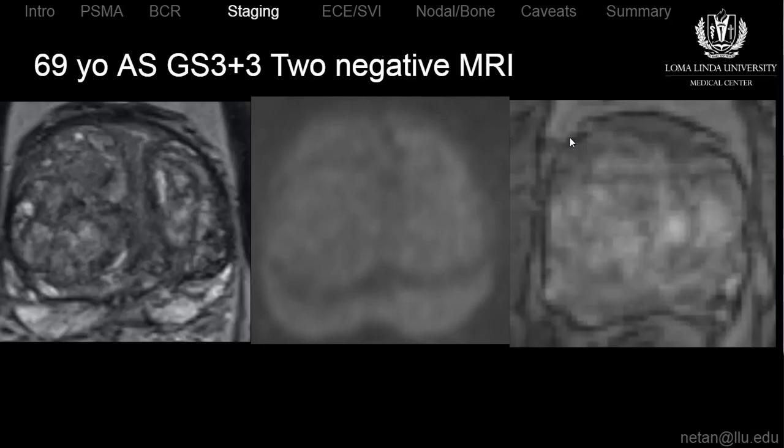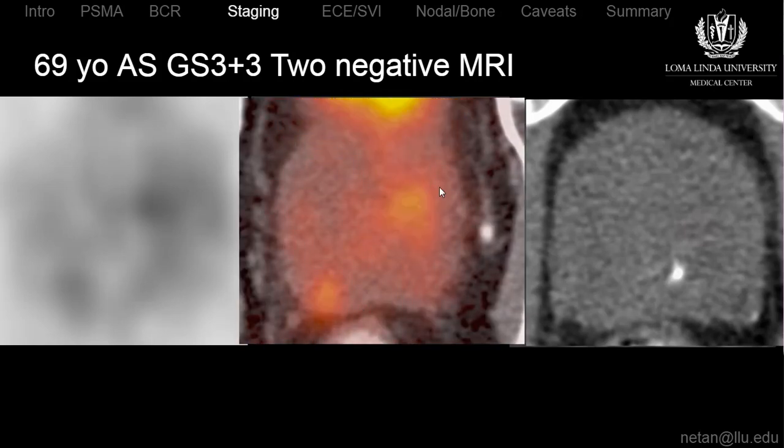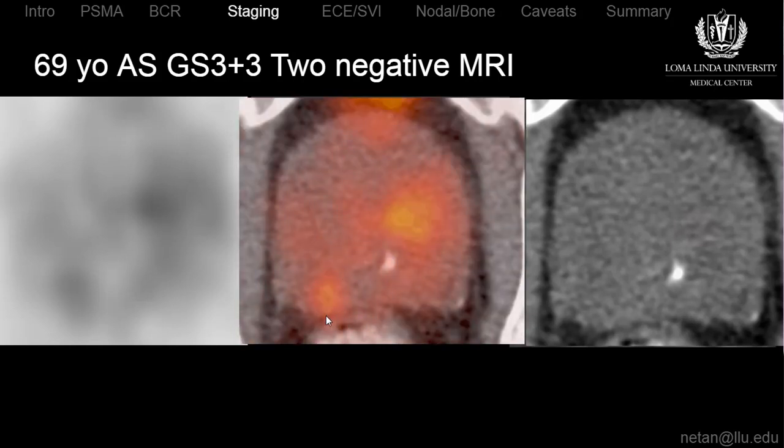Here's an example of a patient, 69-year-old man on active surveillance with low-grade Gleason 3+3 or group 1 biopsy-proven low-grade tumor, and patient had 2 negative MRI, here representative images of the negative MRI, and the patient subsequently underwent PSMA PET, and we see multifocal lesions, here the dominant one in the left transition zone, but an additional focus in the right peripheral gland.